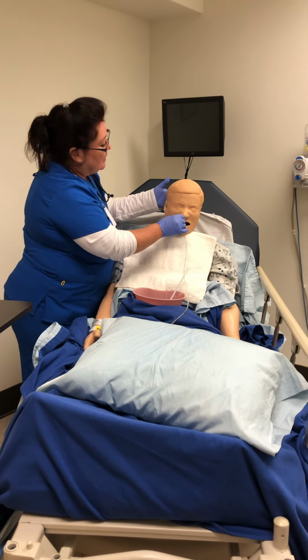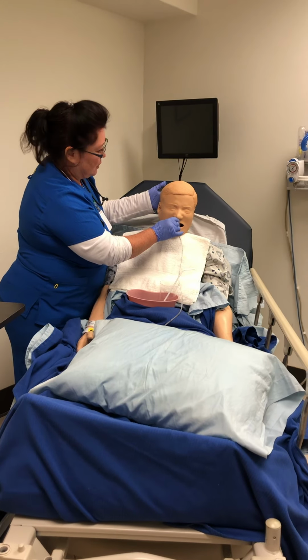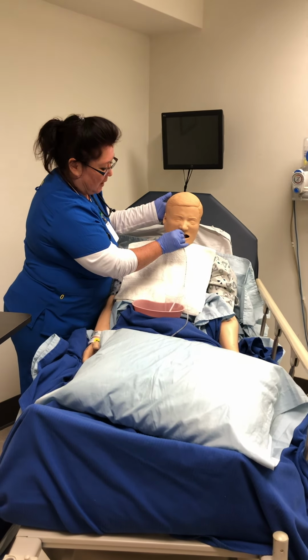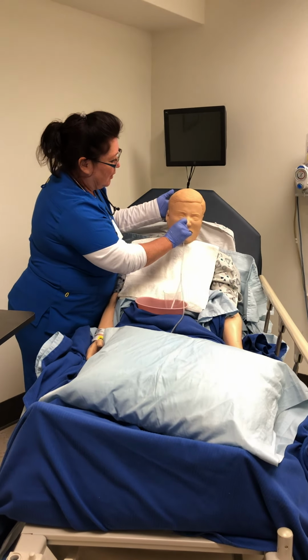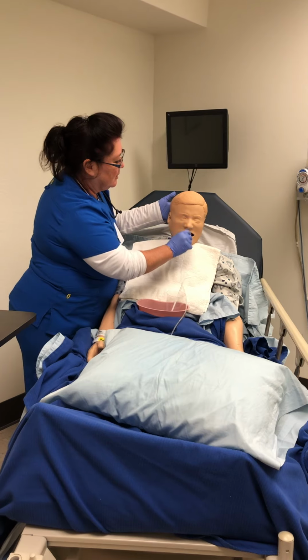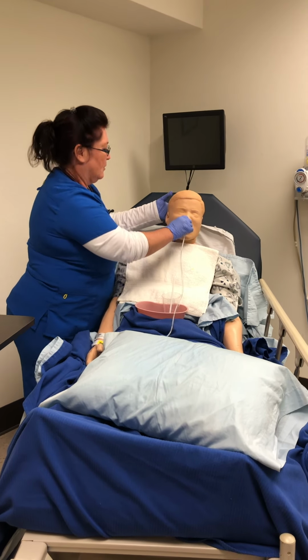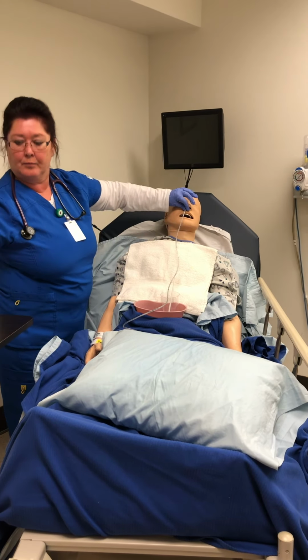Okay, Shirley, now I need you to drink, and each time you swallow, I am going to push the tube in, okay? So on the count of 3, I need you to start swallowing. 1, 2, 3. Swallow, swallow, swallow, swallow. Perfect. Okay, so now I'm going to attach it.